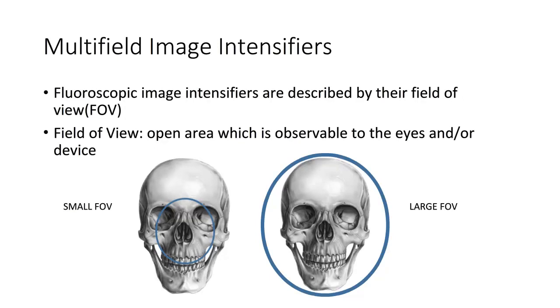Multi-field image intensifiers allow the technologist to choose multiple size fields of view. For myself, I see this being applied in OR procedures most often. The doctor will often ask the technologist to mag an image. The technologist is actually choosing a smaller field size.